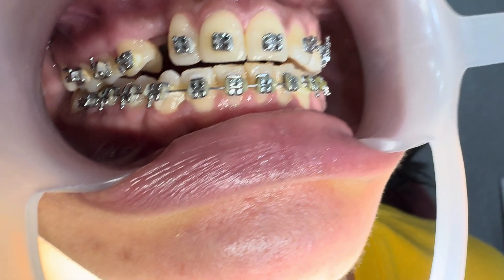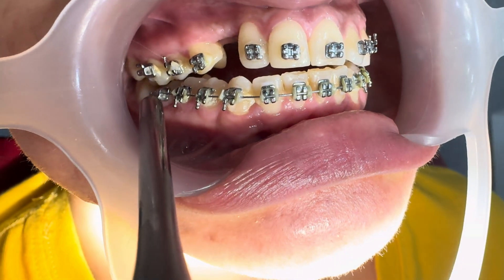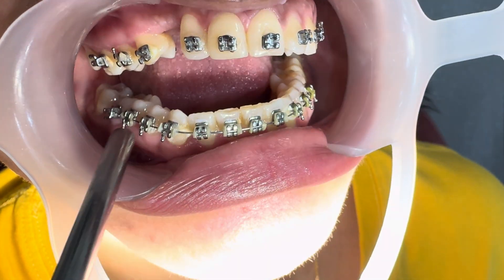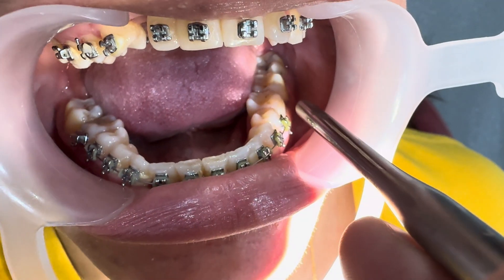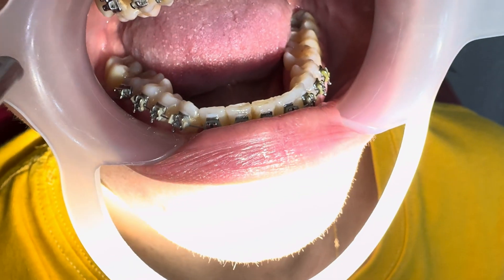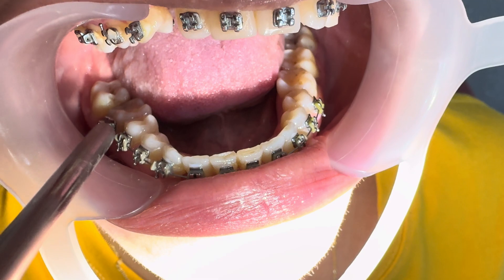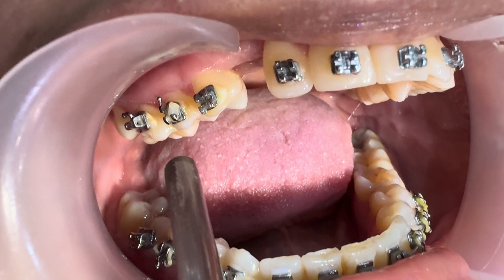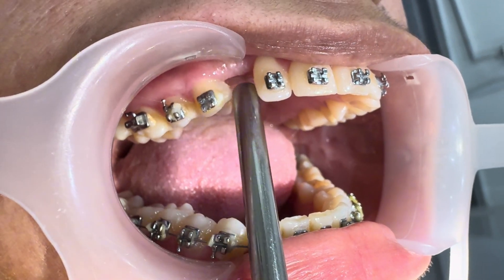When we are talking about the impacted canine, we are talking about a complicated case. For any complicated case — or even any case — we should attach brackets to teeth one, two, and sometimes the third molar. We need to include those teeth to maintain balance. Skipping teeth is totally wrong.